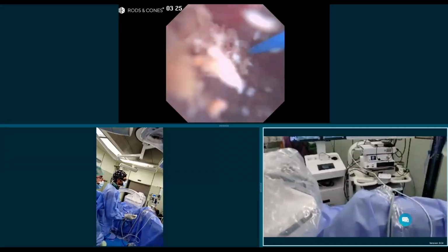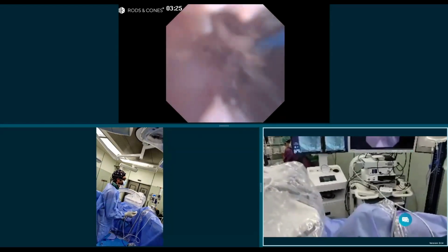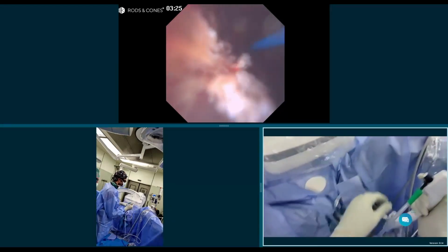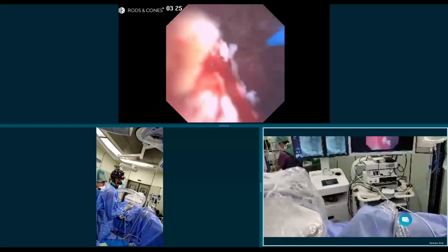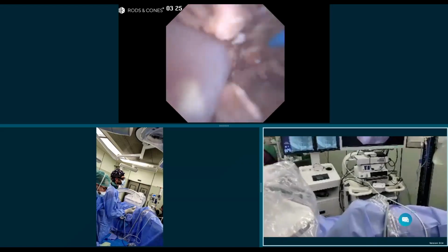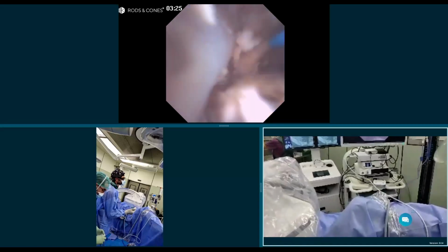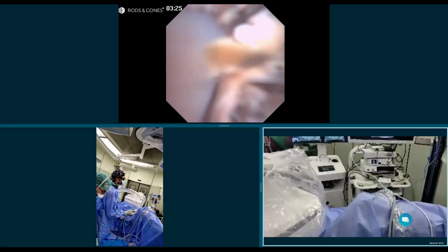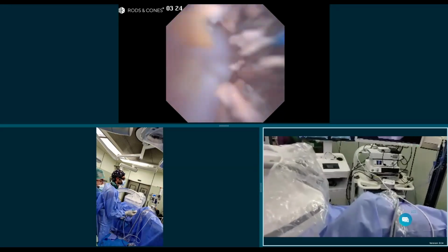Just a little bit of extra, just gravity. For popcorning, remember, just gravity. The important thing is then when you activate the laser, you have active irrigation to decrease the temperature. You don't need to have manual or constant irrigation, but even if you have gravity irrigation, constant irrigation, you will reduce temperature increases. So this is very important. I like only gravity. You have irrigation, you reduce temperatures, but you are not expelling the stones away from the scope.